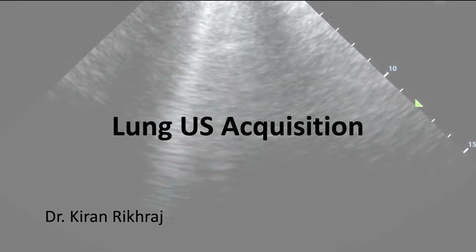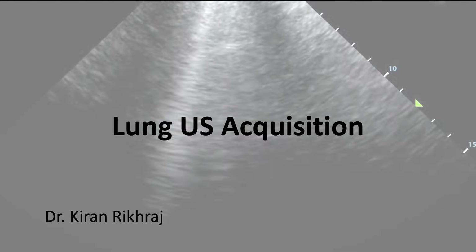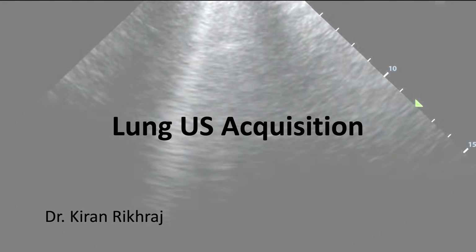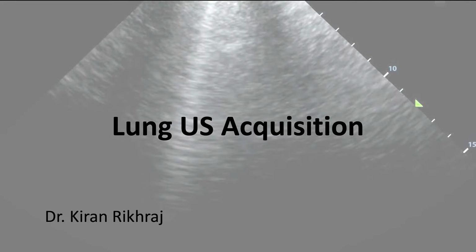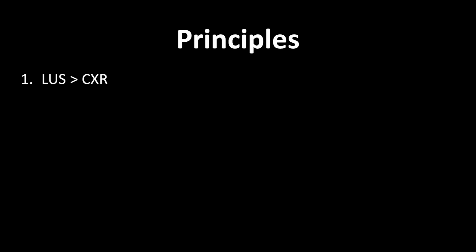Today's screencast will cover the fundamentals of lung ultrasound acquisition. Gaining experience in lung ultrasound is invaluable to anyone who cares for acutely ill patients. I will be following the screencast with a deep dive into lung ultrasound interpretation. Let's get started. It is important to appreciate a few key principles.